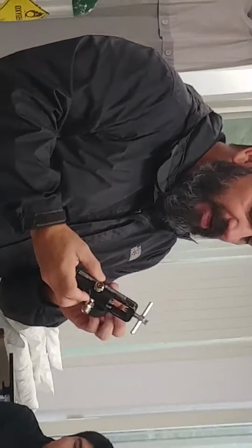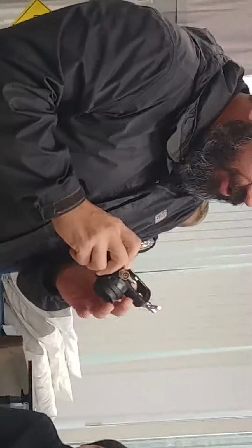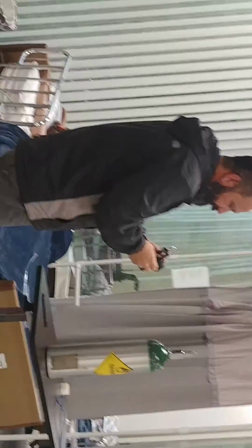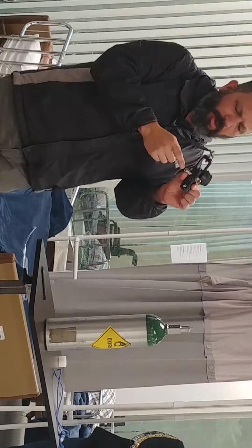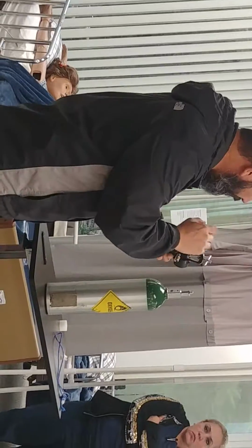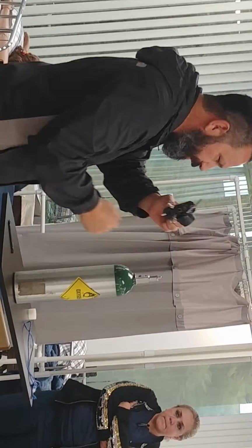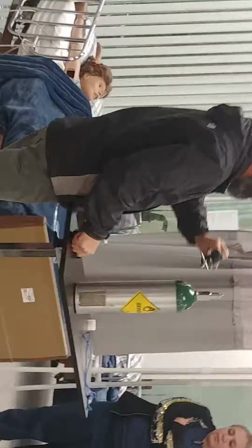So we need to visually inspect to make sure that O-ring gasket is in place. Now this is what it looks like with the gasket in place. So once the O-ring is in place, we'll put it on onto these two ports, and then you can see it in place, and we'll describe all the other added components.